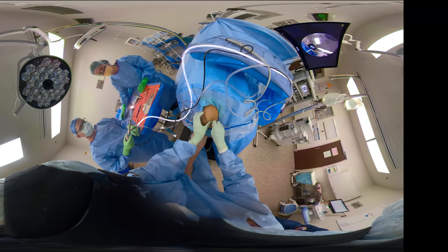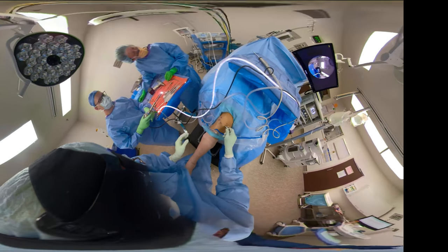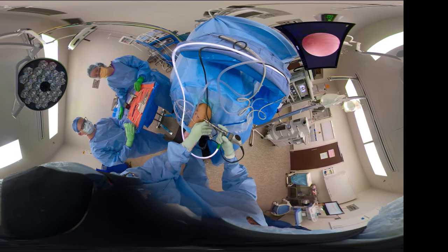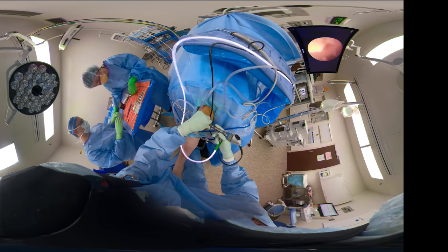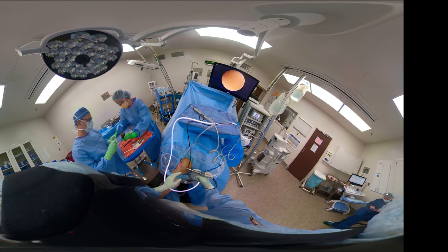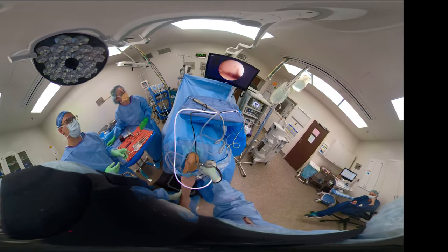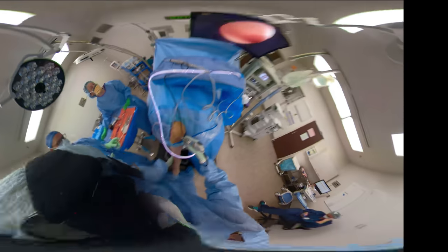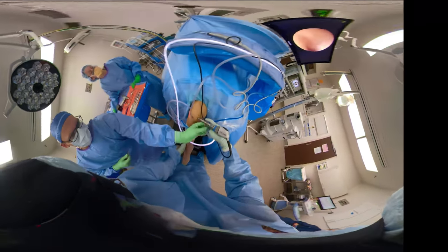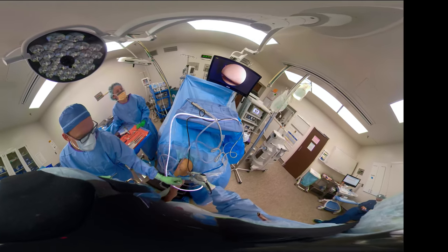Put the scope back in the medial portal with the cannula and the obturator to avoid any damage to the tip of the arthroscope. Put it in, lock it. Looking in that lateral compartment. So to get in the lateral compartment to do the work, we're going to have the leg go into varus. We'll put our thigh on the foot to go into more varus.